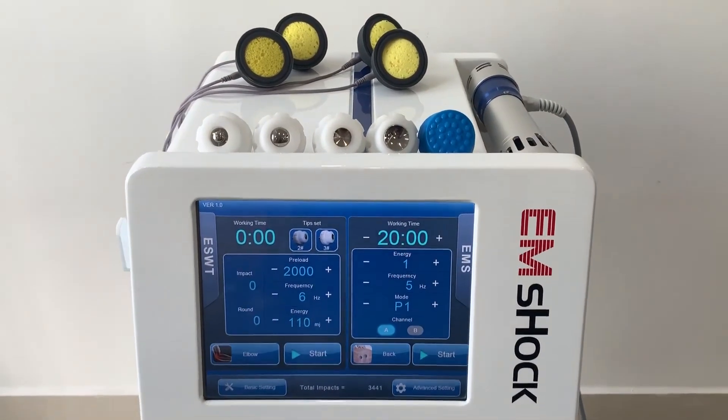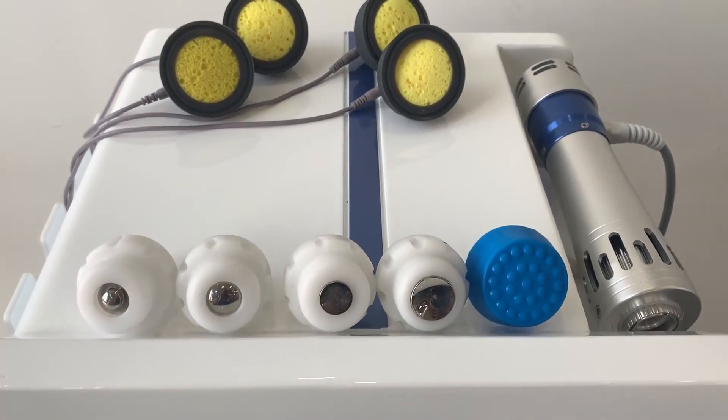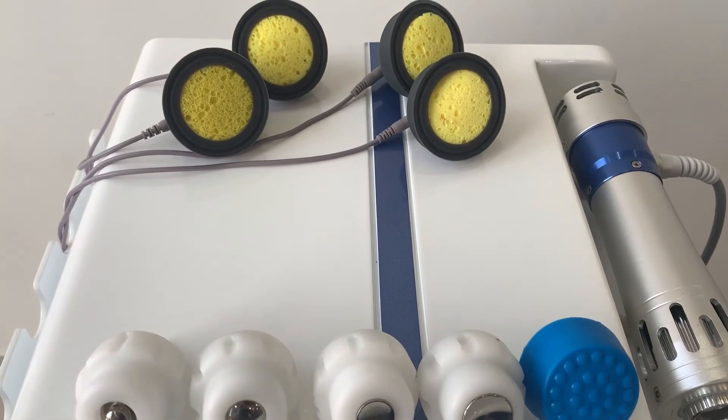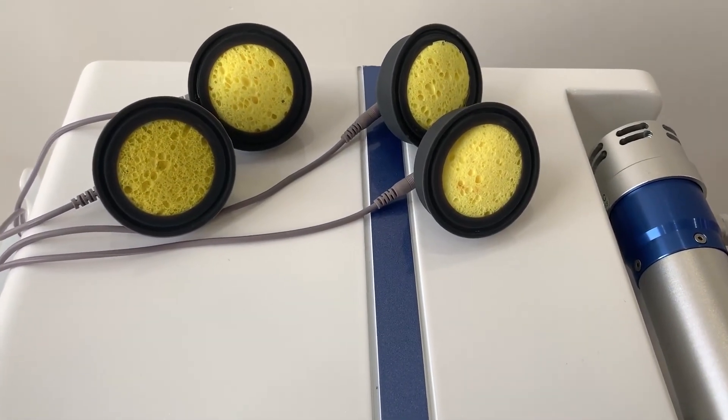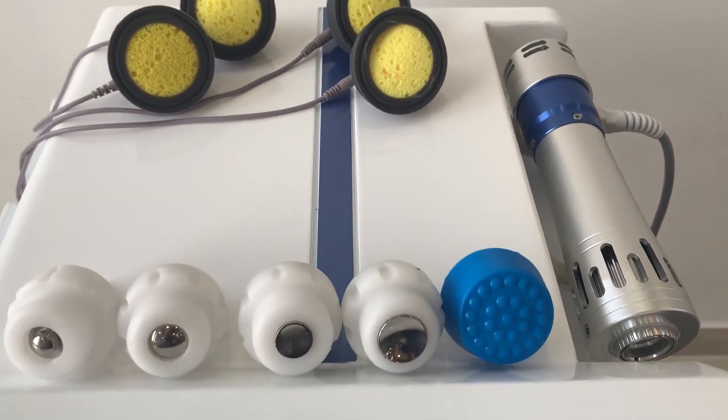EM Shock is useful in many different areas: pain relief, muscle growth, stress training, sports recovery, fat reduction, bone treatment, and ED treatment.